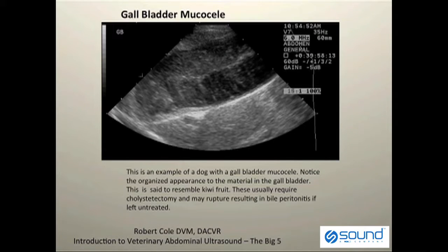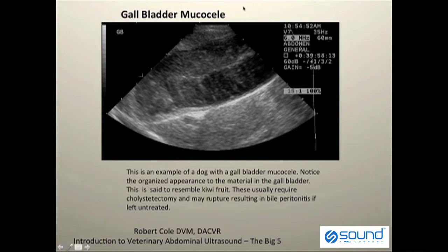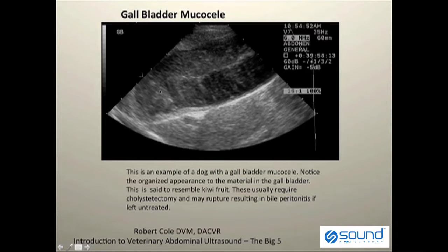This is an example of a gallbladder mucocele. Gallbladder mucoceles are a common problem being recognized more frequently, especially in our smaller and medium-sized patients. A mucocele has what we refer to as organized sludge within the lumen of the gallbladder, with characteristic finger-like projections emanating from the central portion of the gallbladder.